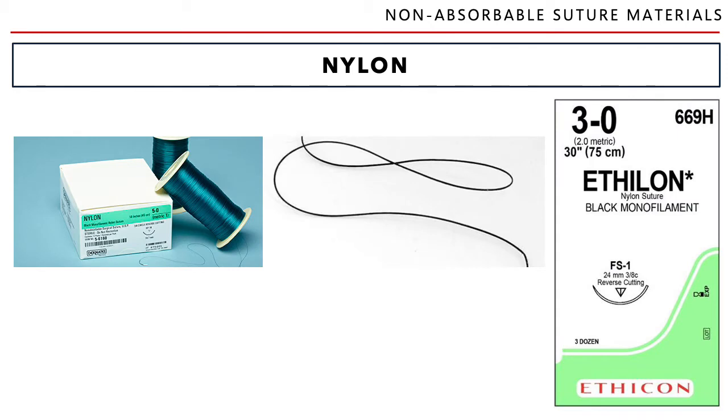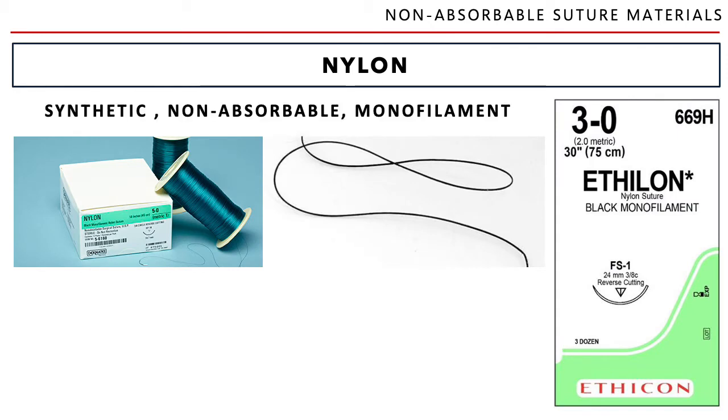Nylon, very much commonly used. One, it's cheap, and it's the non-absorbable suture of choice for superficial skin laceration closures. If you've ever had a big wound, they usually close it either with nylon or with silk. It depends, but usually I think they use suture.